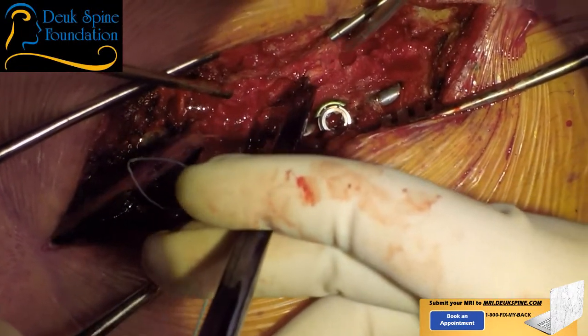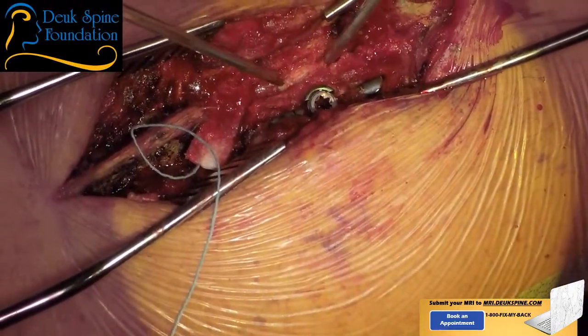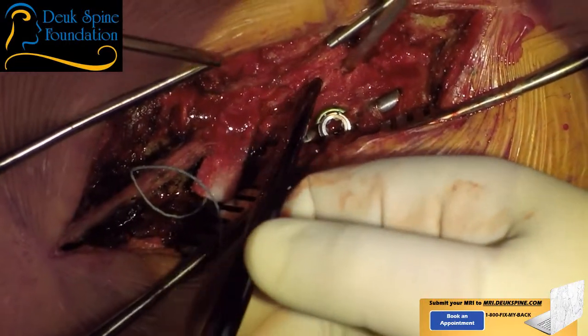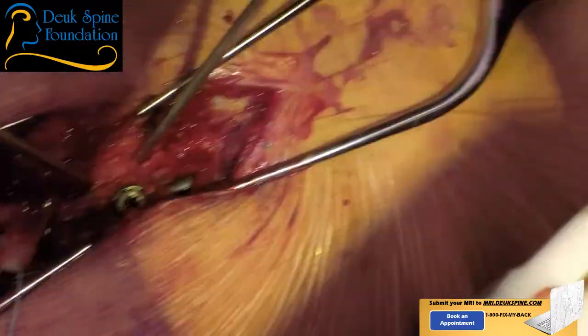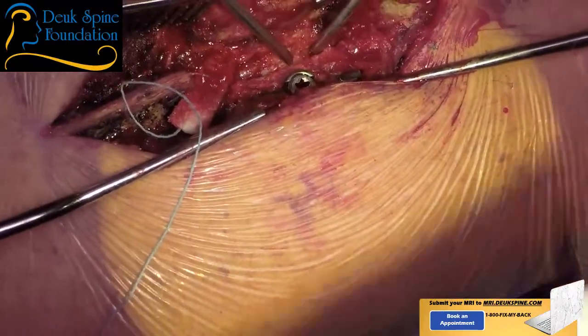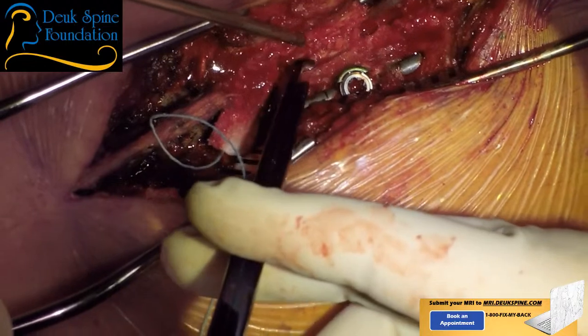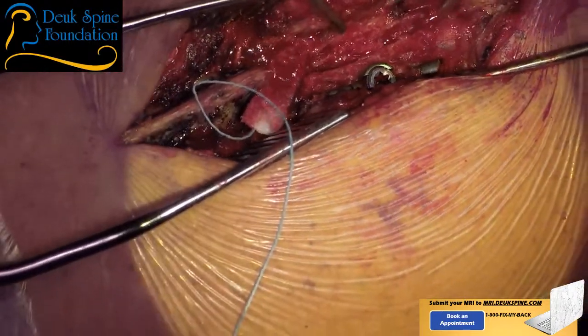That's enough. I need to feel the plane. Don't push it down. So for those of you who don't know what I'm doing, I'm actually feeling with the instrument. I'm feeling with this footplate. I can literally feel it sliding or not sliding. And you want it sliding. Sliding means you're in an area between the dura and the ligament.